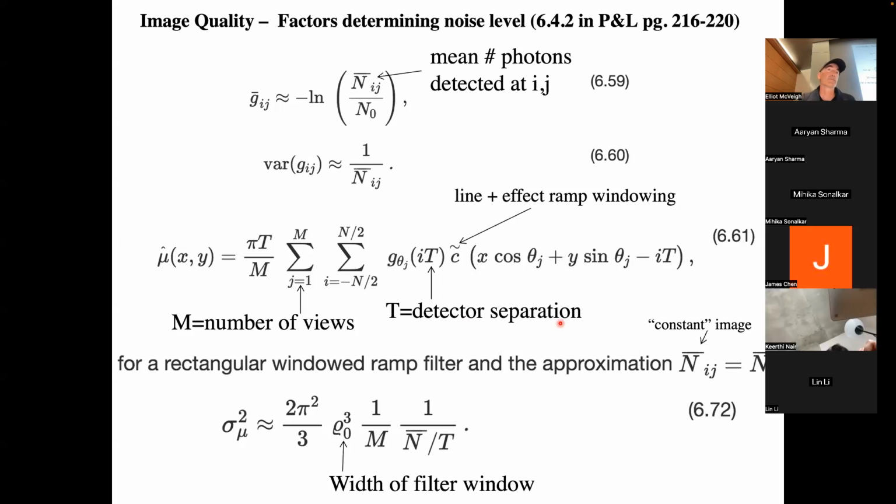And we've discussed this before, that for generations, the detector separation on a CT detector has been 1 millimeter, right? Just recently, Canon, when they were Toshiba, created a detector that cut that down to 0.5 millimeter in 2 directions, right? And we'll take a look at the consequences of that a bit later. But for all intents and purposes, most CT scanners, this detector separation is 1 millimeter, like that.